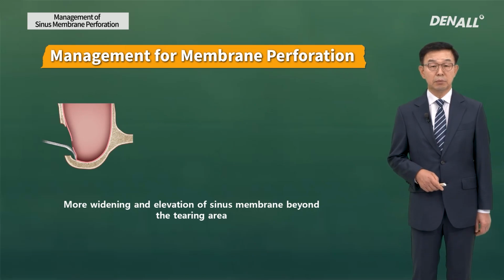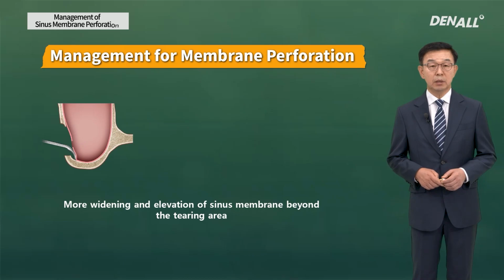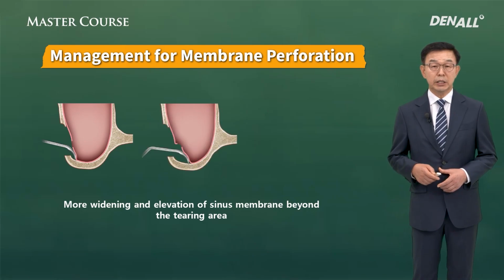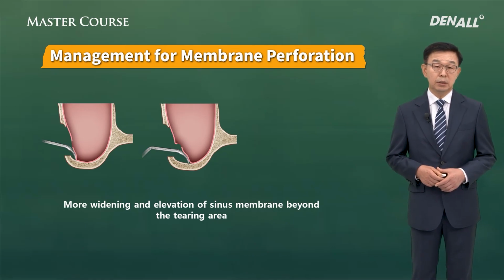Once tearing is done, around that, you need to pay a lot of attention to lift the sinus membrane. If you don't pay enough attention, the area can increase in size. You need to look at the area where it's torn and lift the sinus membrane with caution.